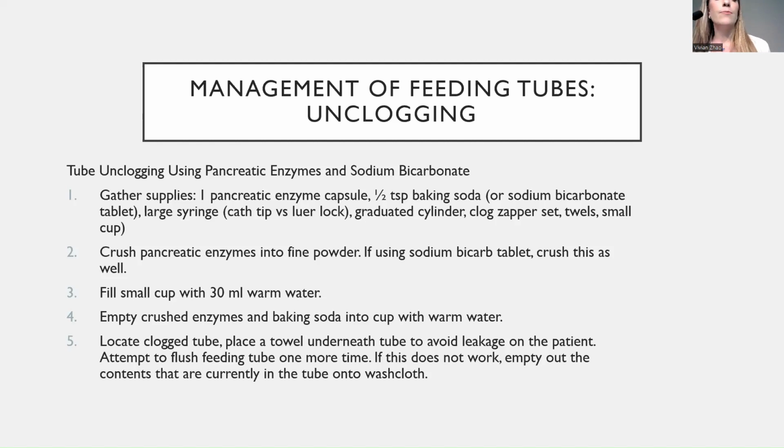Crush the enzymes into a small powder, crush the sodium bicarb into small powder, or use baking soda. Fill up a cup with 30 milliliters of warm water and put the enzyme mixture in there. Then, of course, you introduce yourself to the patient, let them know what you're doing, and make sure you have your towels and stuff around, because it does get kind of messy if there's a clog. If you push too hard, a lot of it's going to come back at you.